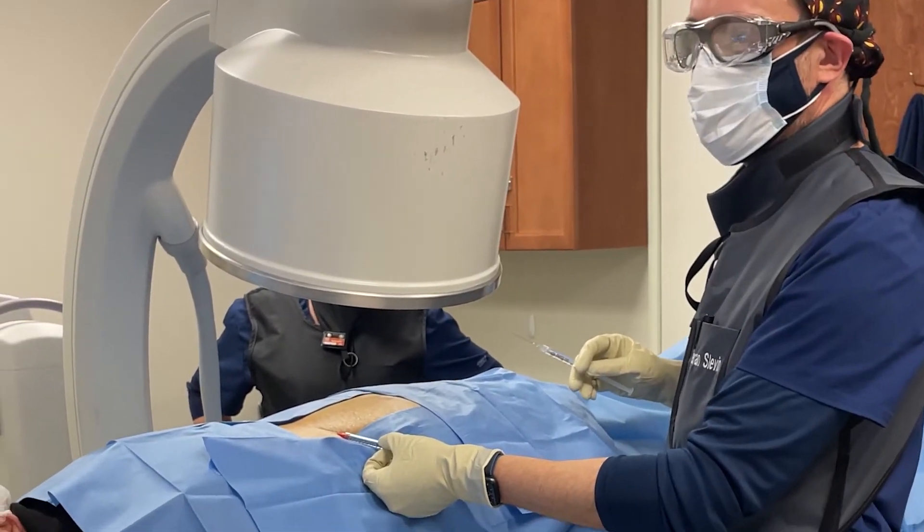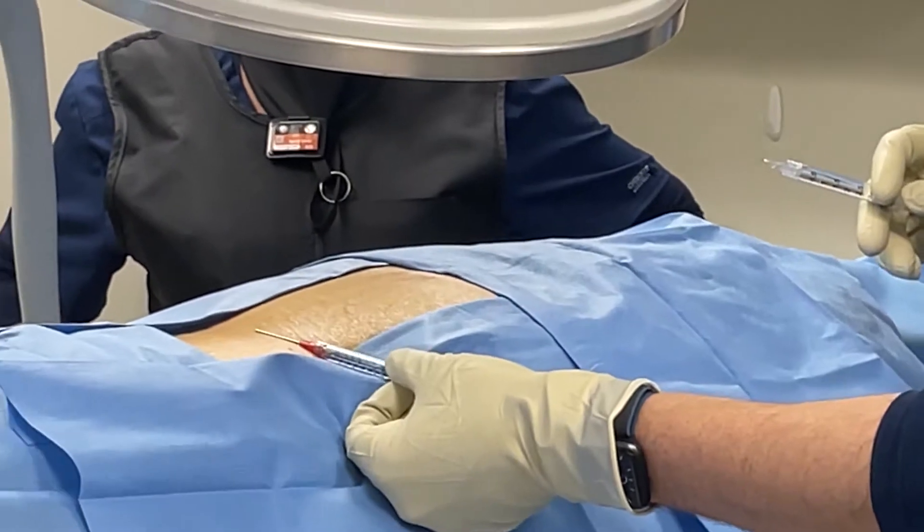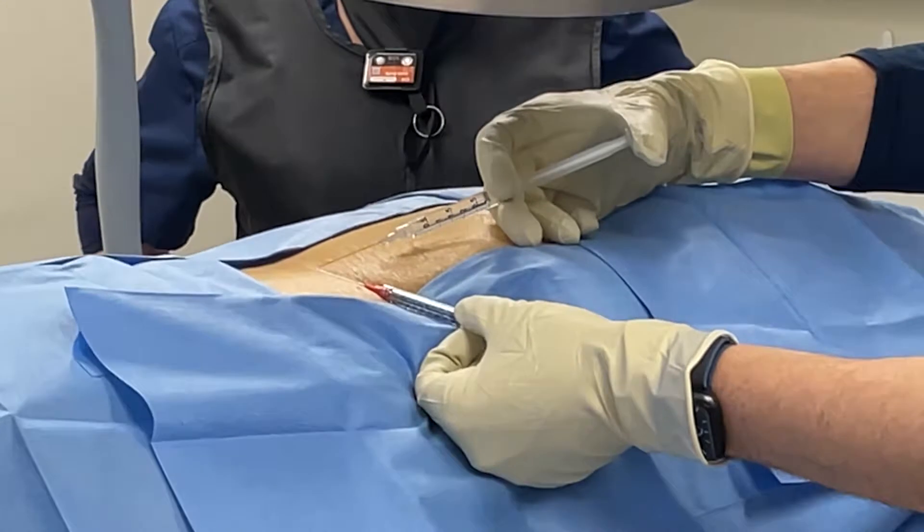So, the first order of business, obviously, is sterile draping, as you can see. The patient is fully draped with the area kept exposed.